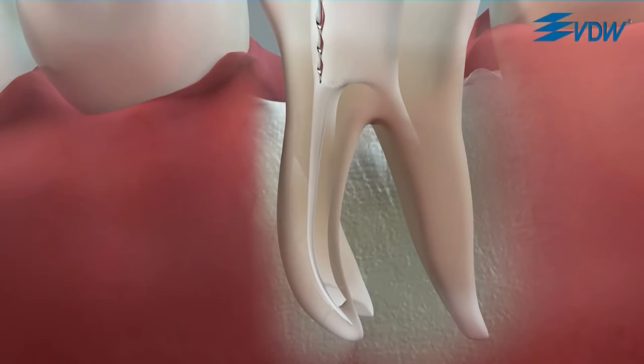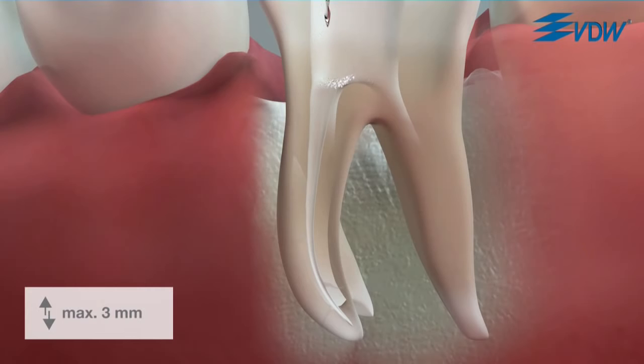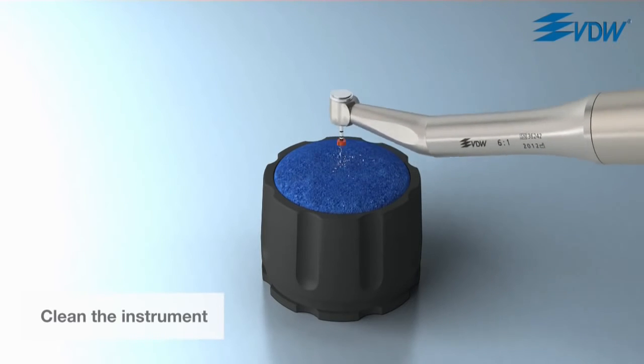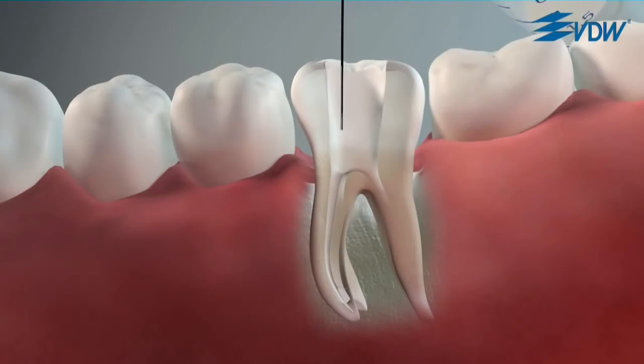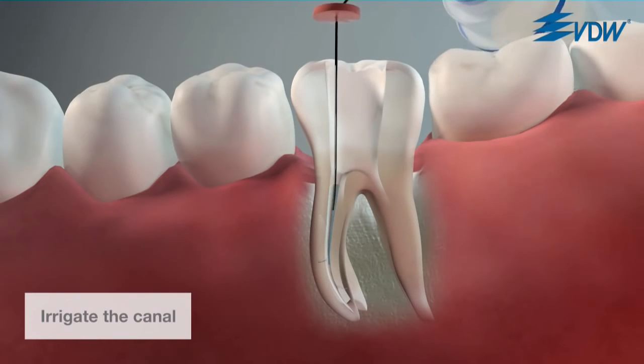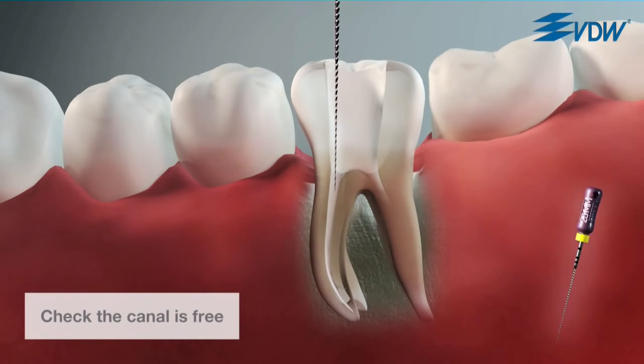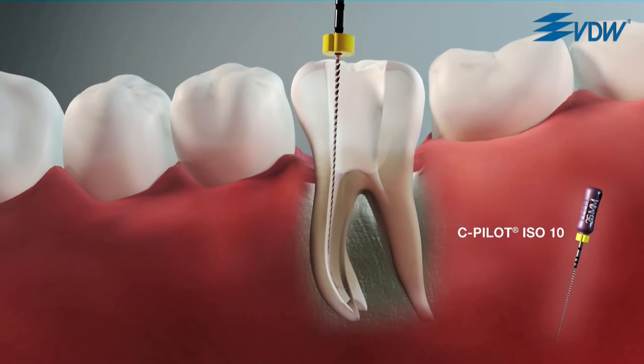You will immediately feel that the instrument advances easily in the canal. Make sure that the amplitude of the movement does not exceed 3 mm and that you make only 3 consecutive pecks. After 3 pecks, clean the instrument in the interim stand. Then, irrigate the canal. Now check that the canal is free with the help of a C-Pilot file size ISO 10. Continue in this manner until approximately 2/3 of the canal length has been reached.